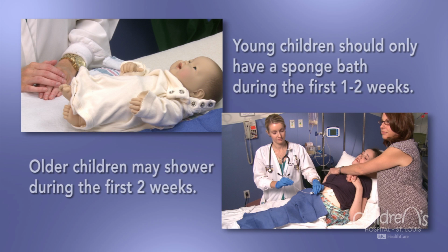Young children should only have a sponge bath for the first 1 to 2 weeks. Older children may shower for the first 2 weeks. This helps to protect your child's surgery site. After 2 weeks, both younger and older children may have baths.